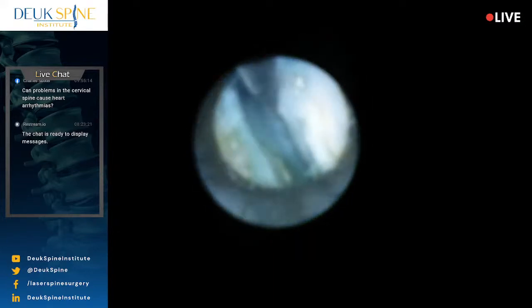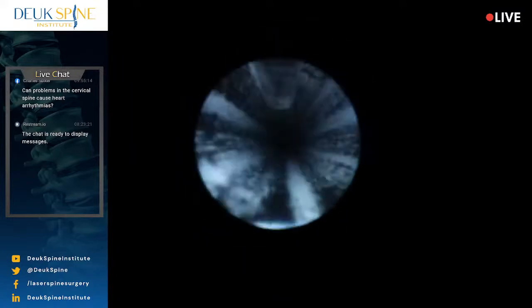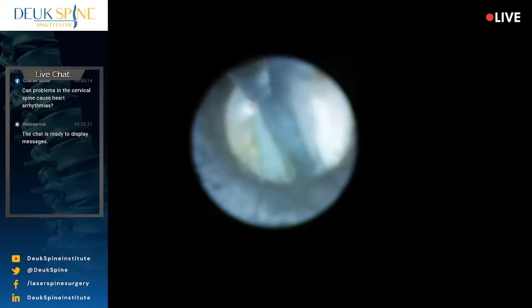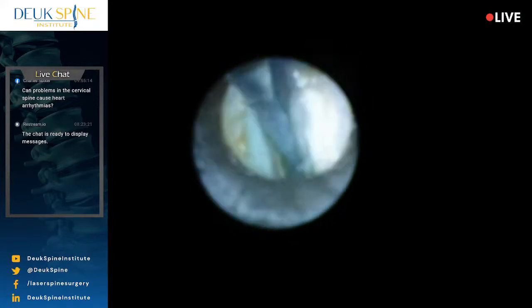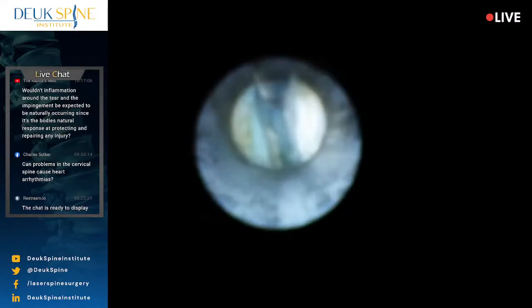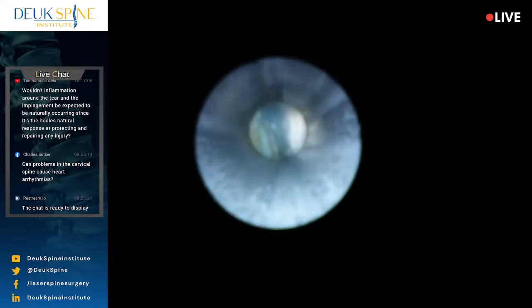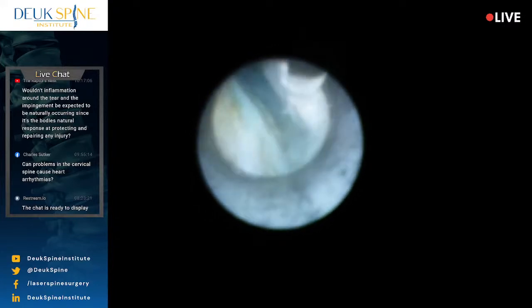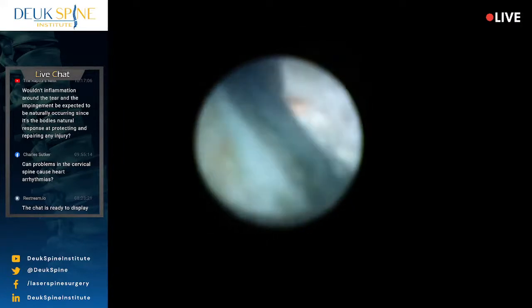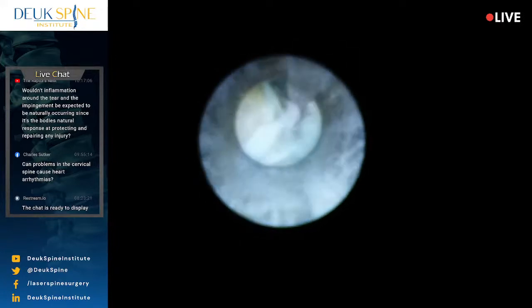How many more scopes do we have? They're all ready to go? Yeah, ready. That was a bone spur I just shaved down. Any questions? Any questions from our audience?